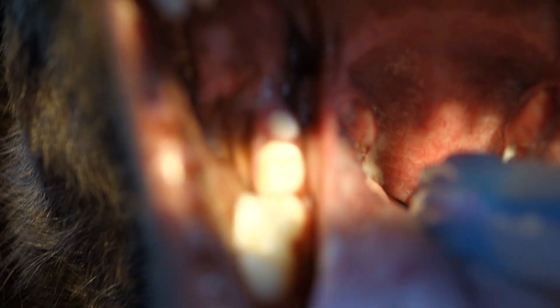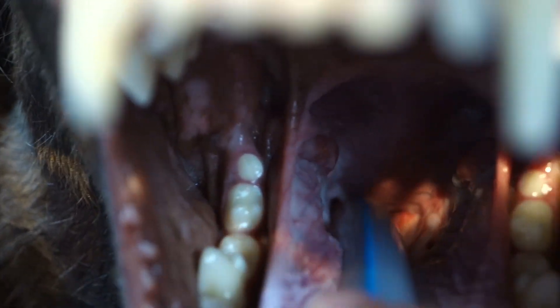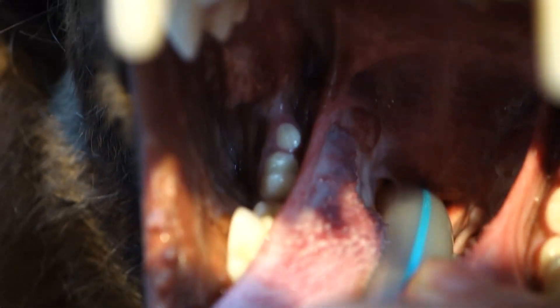We've got the soft palate up out of the way. That's the epiglottis sitting right there. At the bottom we have the epiglottis, at the top we have the soft palate. Pull the epiglottis down, and then once the tube is in the way — there's a black hole right there — into that black hole, and we are in. The tube is now sitting right in the middle of the arytenoid cartilages, the soft palate is on top, and we are in.